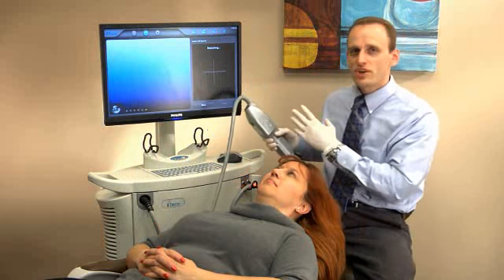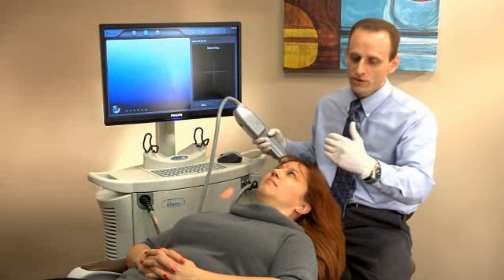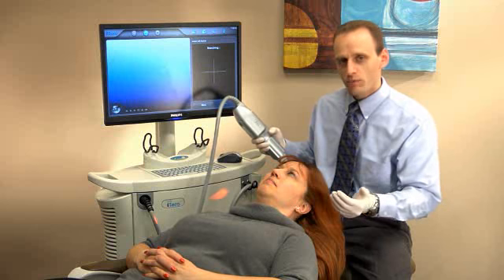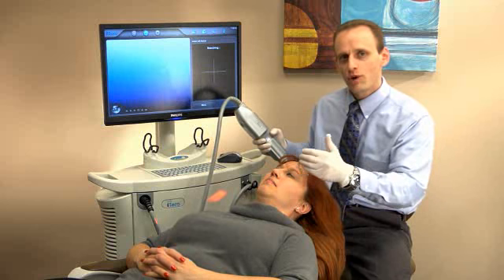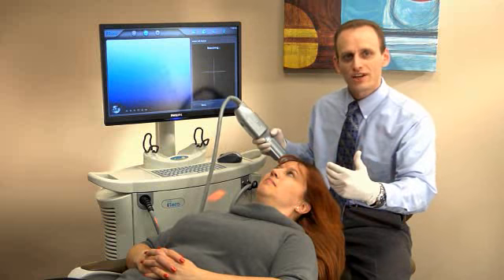Now, the system tells me lower left buccal. This will be an unguided scan, which means I'm going to go to the most distal tooth in the lower left and work my way forward towards the midline. And when I'm done, I'll press the menu button to let the system know that it's done with this segment.